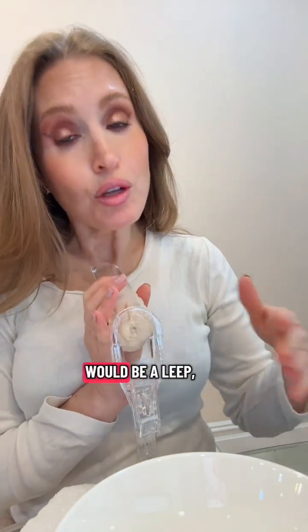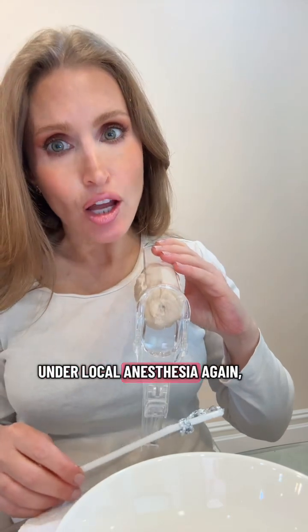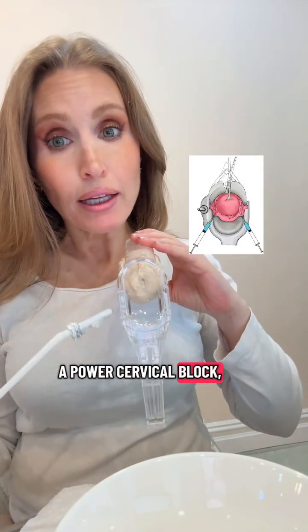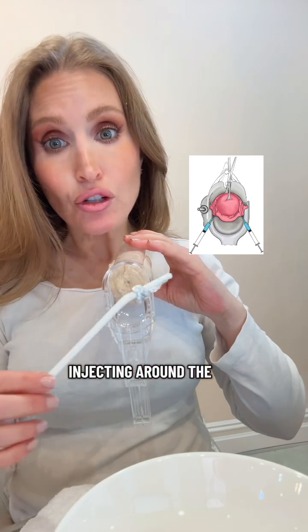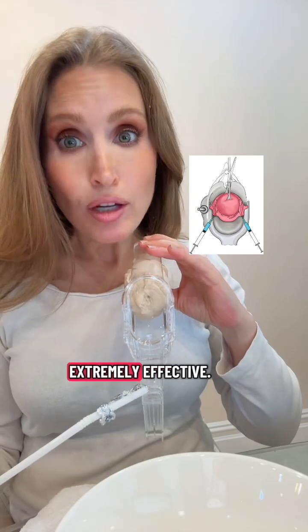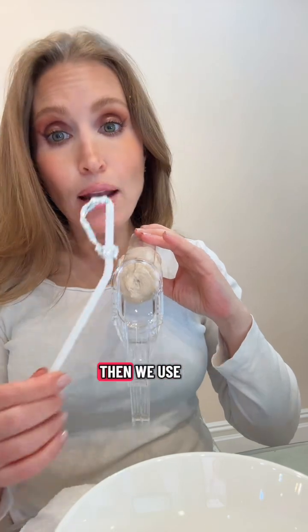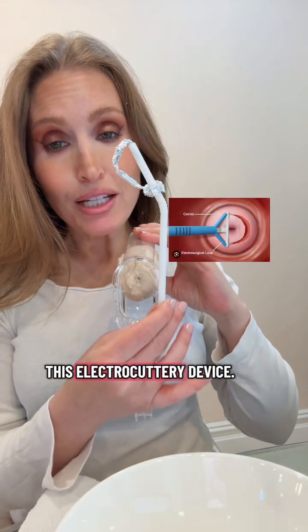The other option would be a LEEP, which is a loop electrosurgical excision procedure. This is when we use a wire loop in the office under local anesthesia. Again, we will do a paracervical block, injecting around the cervix to numb the area. When it's done properly, this is extremely effective. Patients are usually as comfortable as possible. Then we use this electrocautery device.